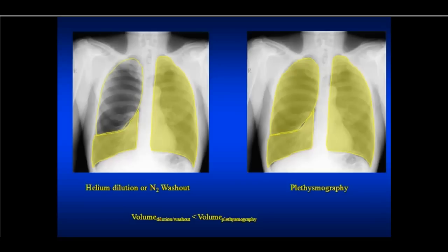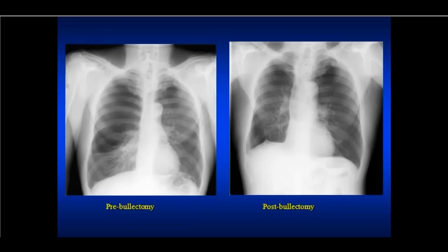We did that. It was huge. We took it out. Patient was great. Got off of oxygen, was able to climb upstairs again. He felt so good he decided to start smoking again, and a year later was back on oxygen. Okay. So here he is pre-bullectomy.